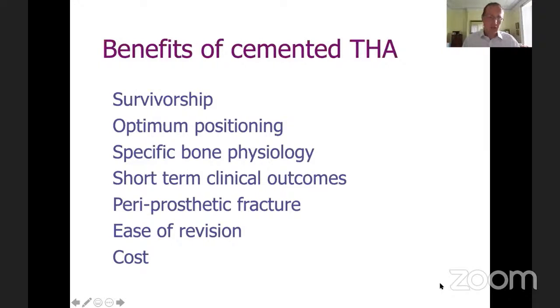All I need to do is just knock the tapered stem out and put a new one in at the end, and it just makes the revision so much easier with good access to the acetabulum. The only time one needs to remove it is for infections. But of course, the risk is lower in those because we've got antibiotic-loaded bone cement. And then finally, in the UK, cemented implants are significantly cheaper than the uncemented version. So really, the question would be, why would you not use a cemented stem?